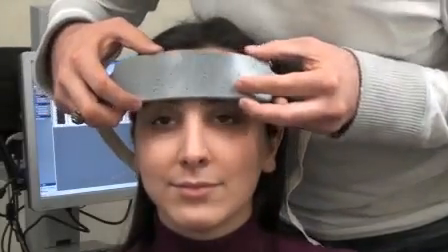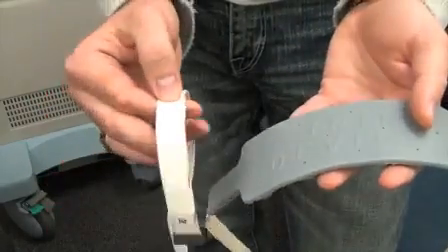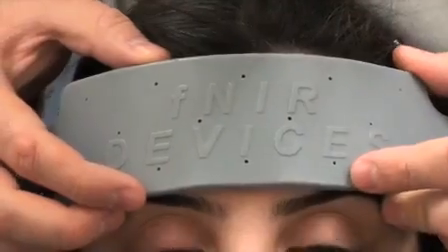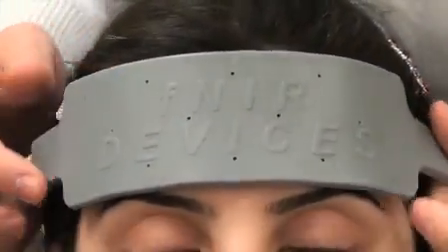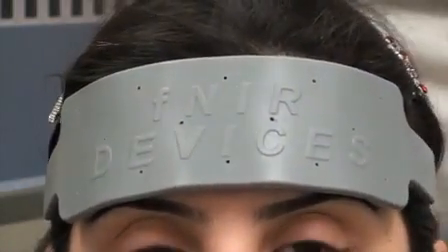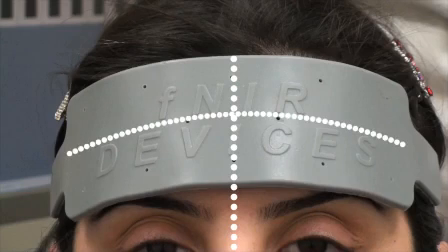The sensor pad is placed over the forehead of the subject. Side 1 should be on the subject's left and side 2 on the subject's right side. The sensor should be placed just over the eyebrows and should be centered vertically. The imaginary vertical symmetry line passes through the midline of the forehead and then the nose. The sensor pad's center line coincides with the midline of the forehead and nose.